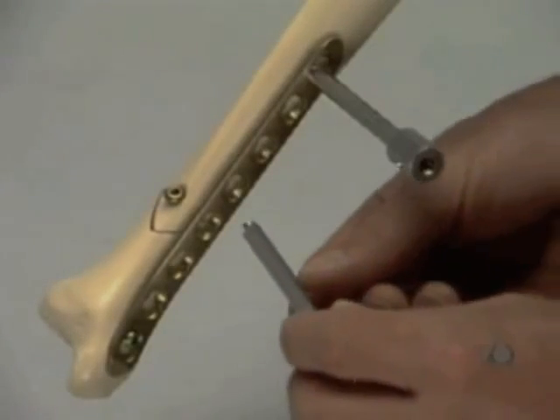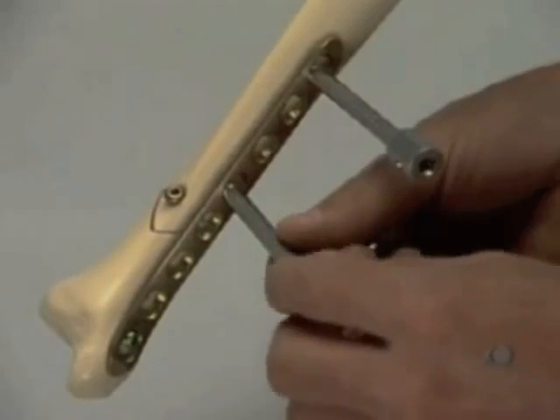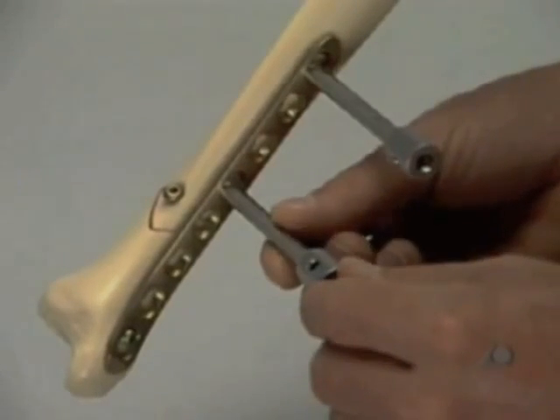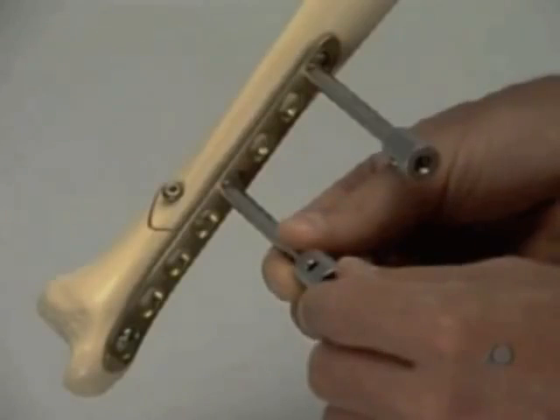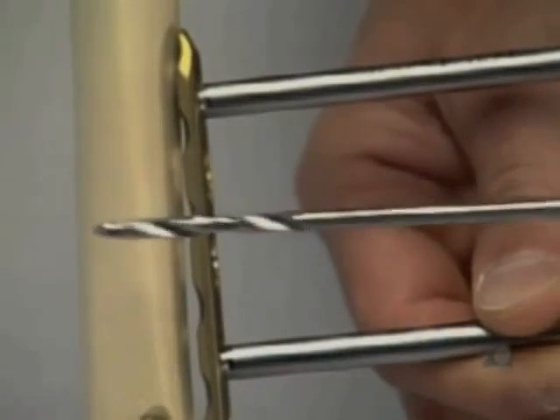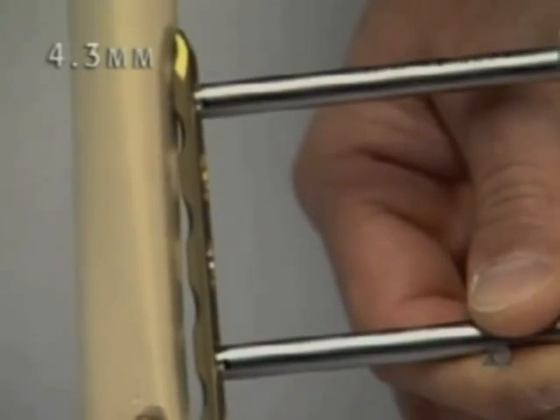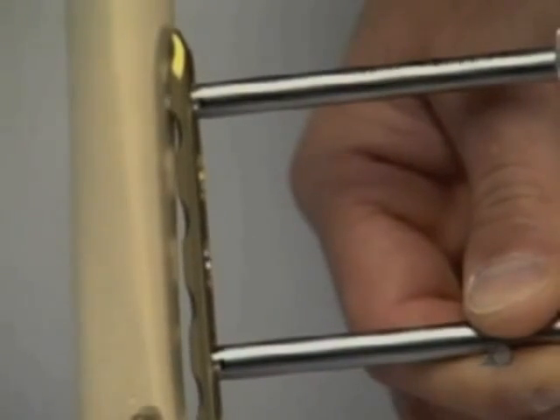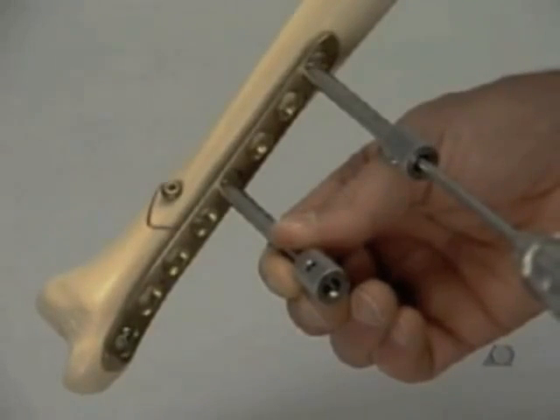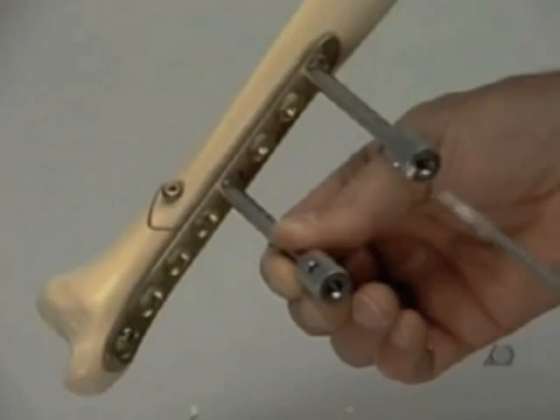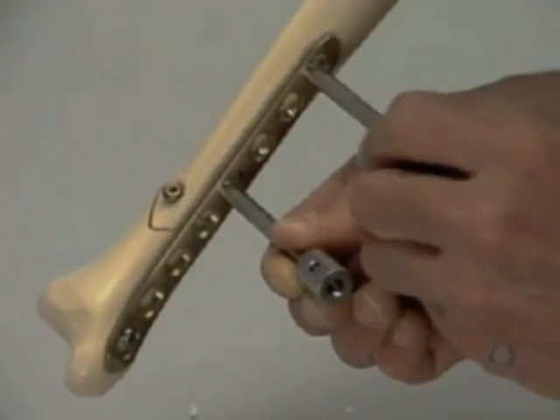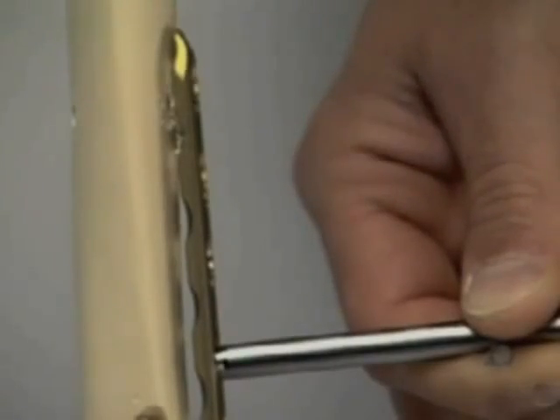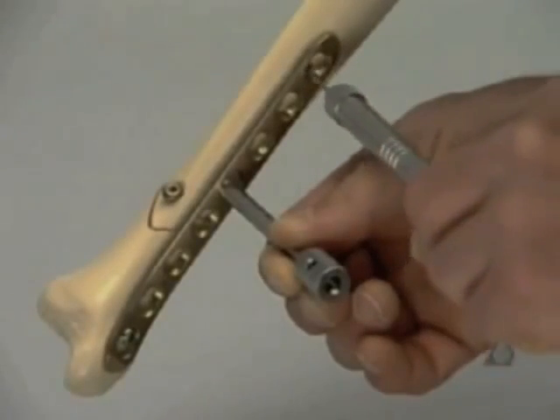The second sleeve is fixed into the fourth hole from the top. Holding the plate firmly with the sleeve, a 4.3 mm hole is drilled bicortically through the most proximal plate hole. The drill sleeve is removed, and the screw length is measured with the depth gauge.